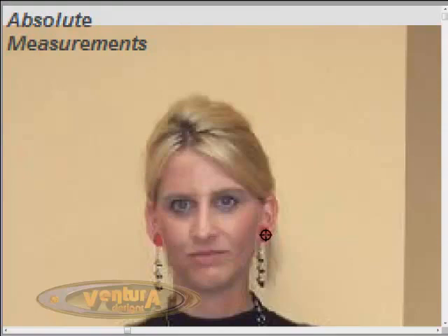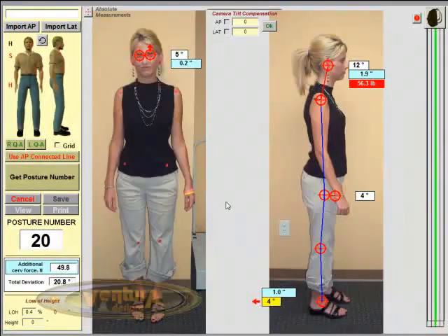And we can use the earlobes. A very easy way is to just use the eyeballs and drop the crosshair right into the eyeballs. And it will generate head tilt, which in this case is 5 degrees. And the Posture Pro has calculated it to be 0.2 of an inch. And you'll see that on the left eye, there's also been an arrow pointing toward the sky. And the arrow will appear on the side that is high. So here we have a left high side, which means the head's tilted to the right.